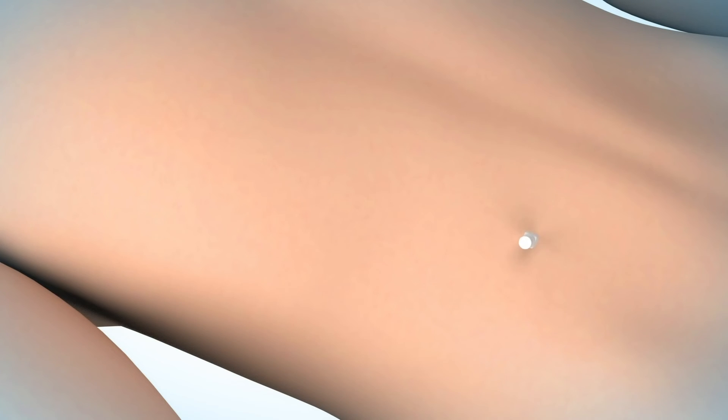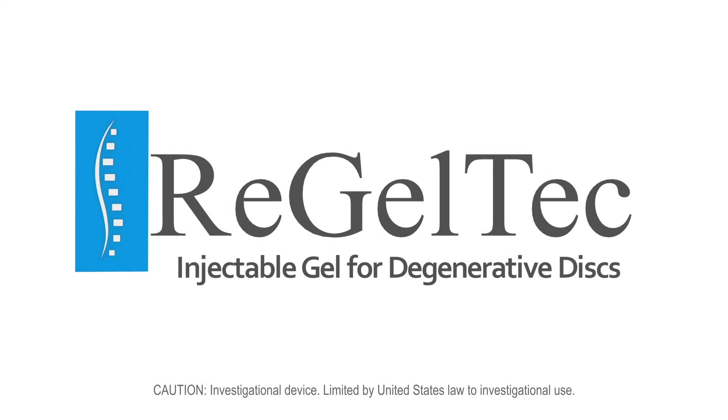After waiting a short period of time for the gel to solidify, the needle and stylet are removed. The procedure is expected to be completed in around 30 minutes.